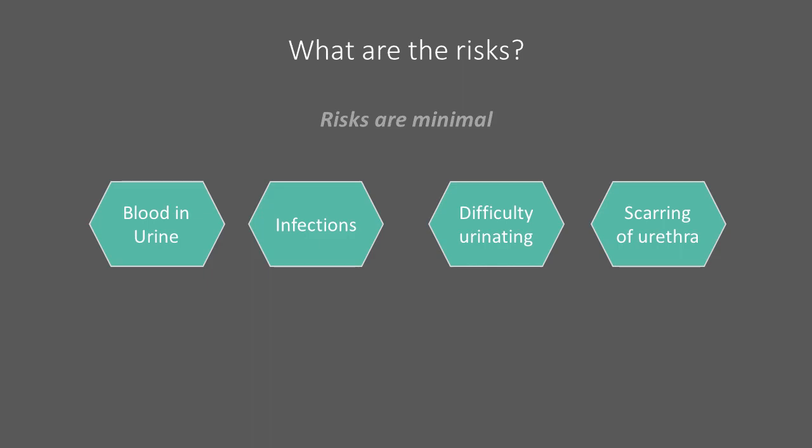Some patients may experience difficulty urinating after the procedure, or more frequent, urgent, or painful urination. This can be lessened by focusing on relaxing the pelvic muscles when urinating. Any time that instruments are passed through the urinary tract, there is a small risk of later developing some scar tissue there, which can lead to symptoms of a blocked urinary stream. The risk of this with modern instruments is extremely small.